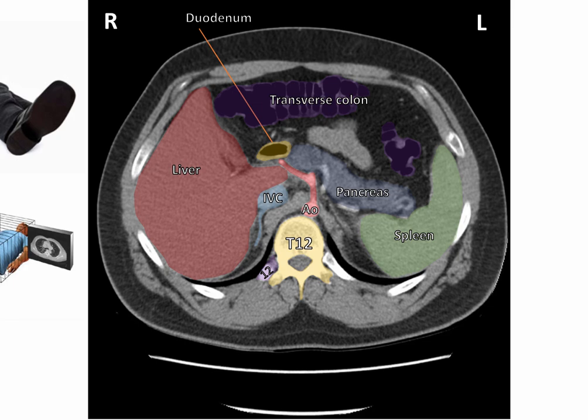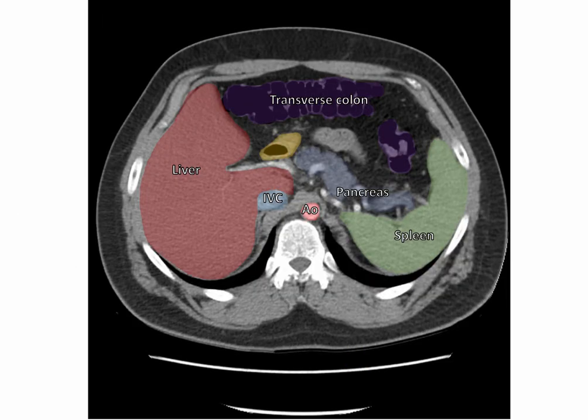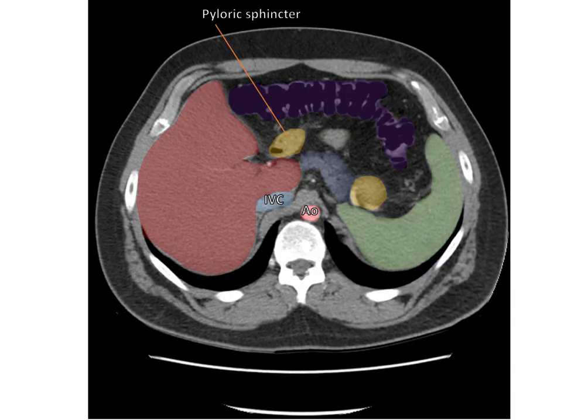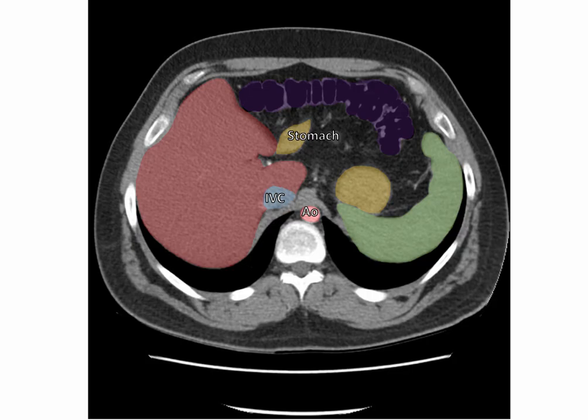The dark areas which we can see here are the costo-diaphragmatic recesses, which are containing pleural fluid. As we move superiorly, we can start to see the pyloric sphincter. This is marking the junction of the duodenum with the stomach.